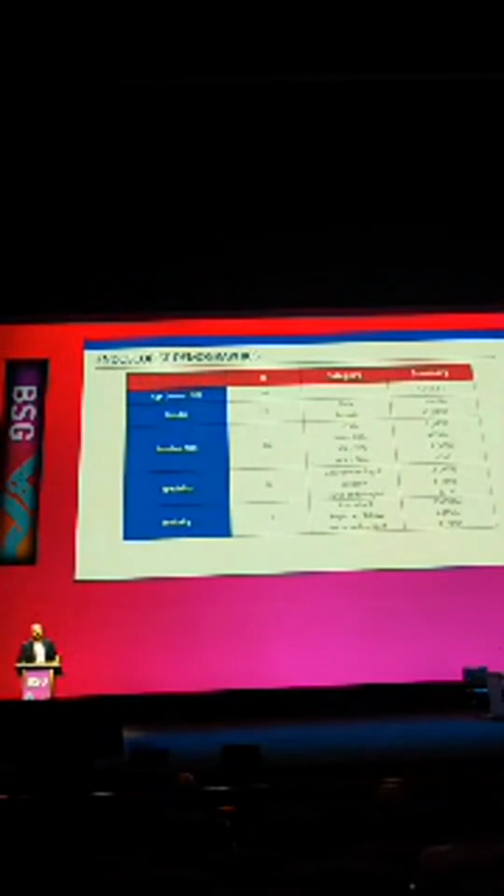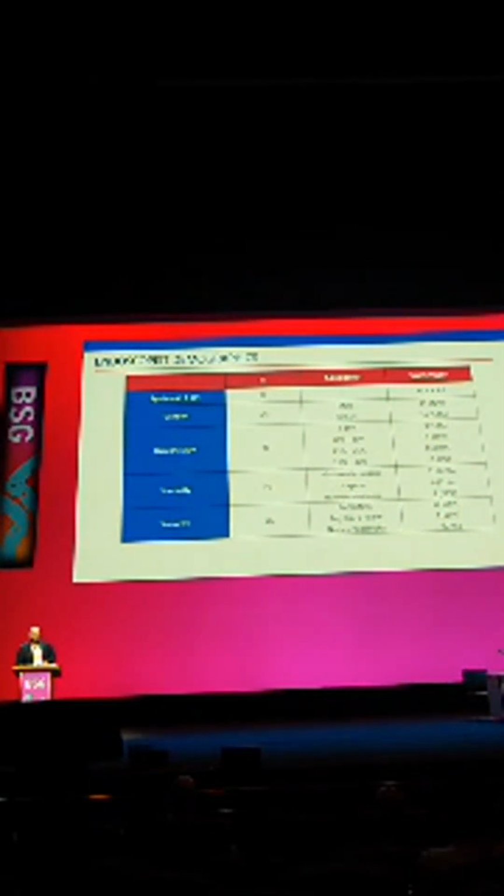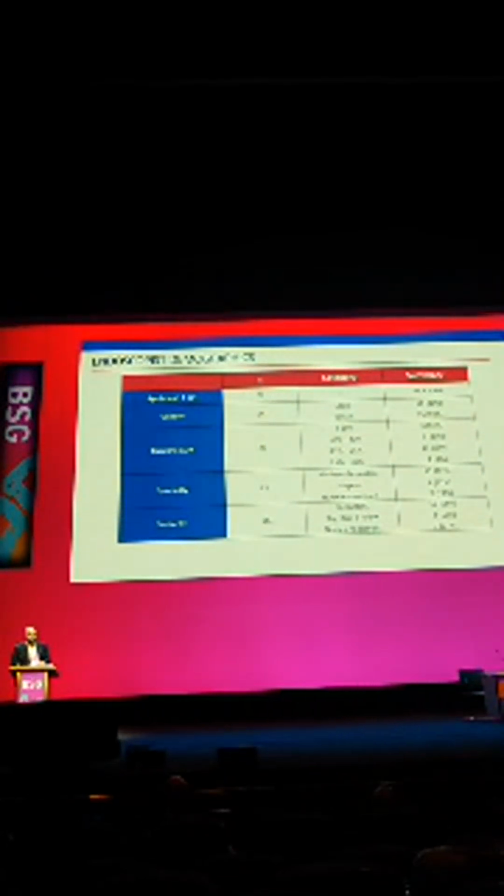So we verified everyone's ADR based on at least 100 of their most recent procedures. Roughly half of them had an ADR between 21 and 30%. The other half had an ADR of 20% or less. So we really had that whole breadth of non-expert endoscopists. And we also included all levels of seniority and specialty who perform colonoscopy in the UK.